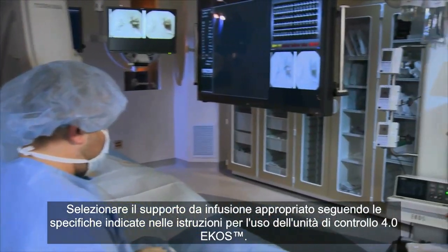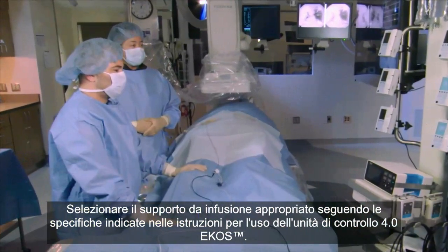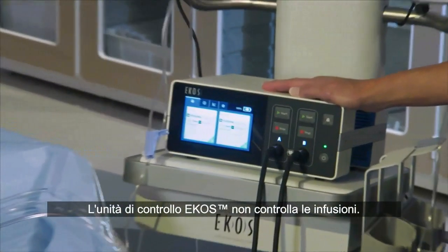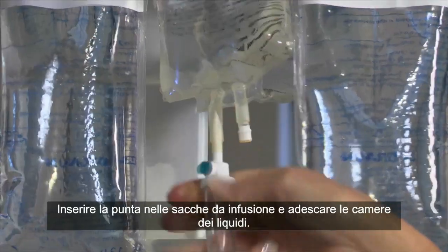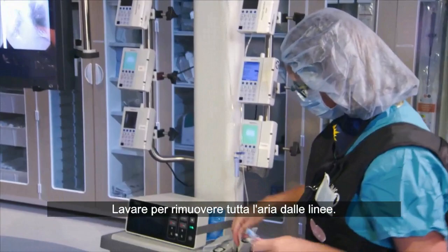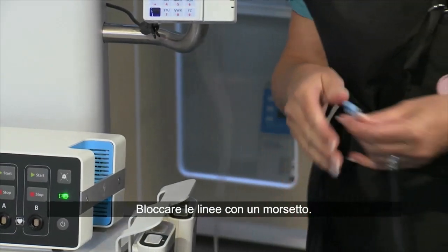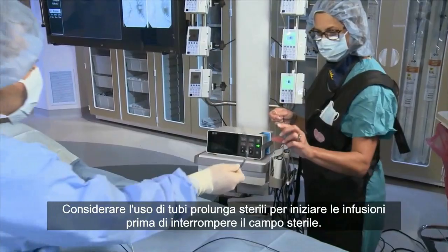Select the appropriate infusion stand following the specifications in the EKOS Control Unit 4.0 IFU. 2 hospital infusion pumps are required per catheter for the procedure. The EKOS Control Unit doesn't control the infusions. Spike the infusion bags and prime the fluid chambers. Flush to remove all air from the lines. Clamp the lines. Consider using sterile extension tubing to start the infusions before breaking the sterile field.